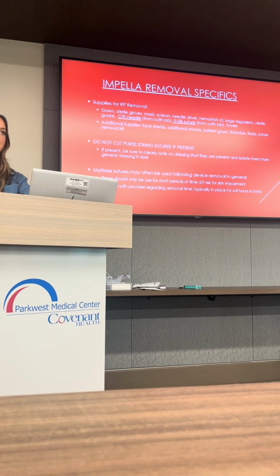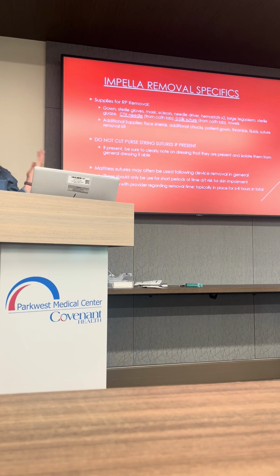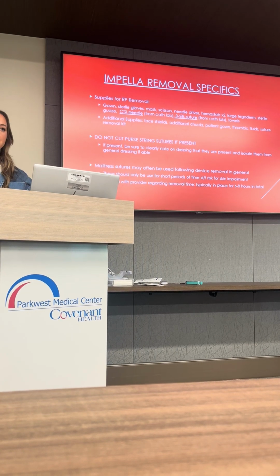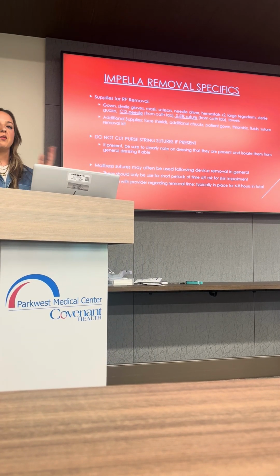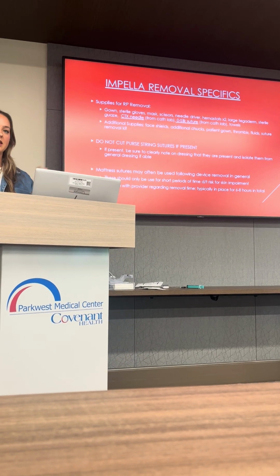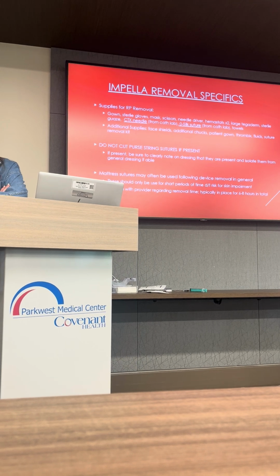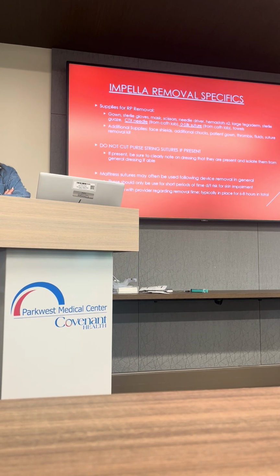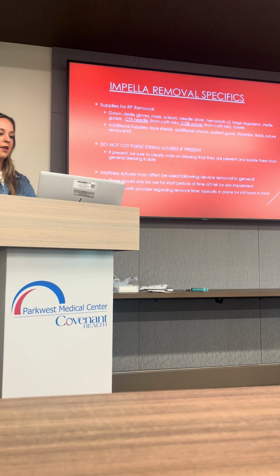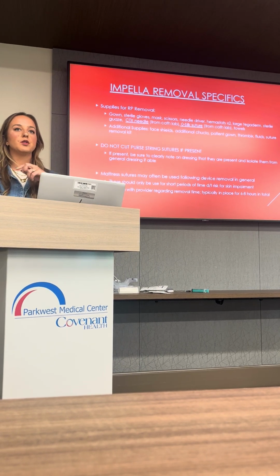Because there's been so many times someone's like, I'm going to go to lunch, and while that person's at lunch, someone's like, I'm going to clean up all this stuff, I'm going to change dressings, I'm going to be productive. And while that's all fine and good, you'd hate for something to happen and those get impaired or cut or removed, whatever, and then all of a sudden you're having to answer for that later on down the road.